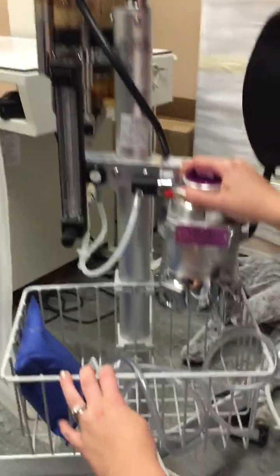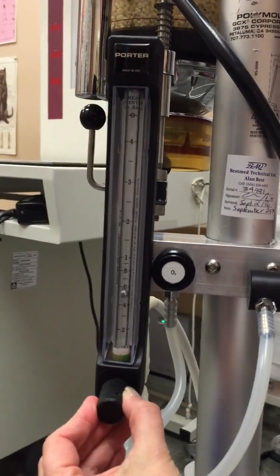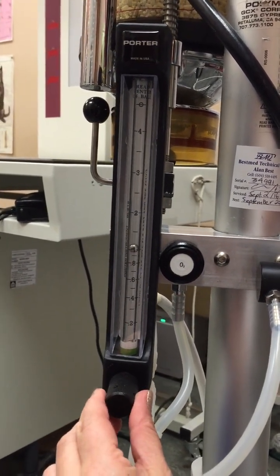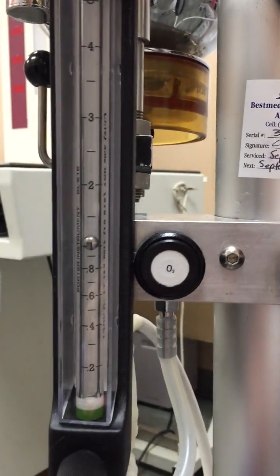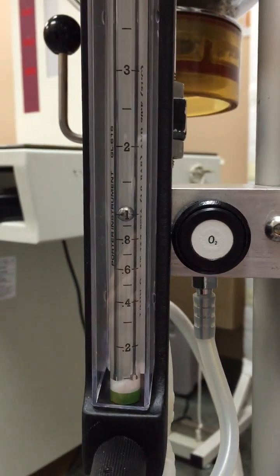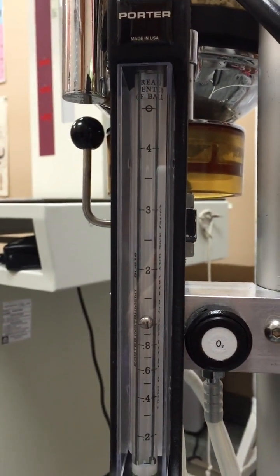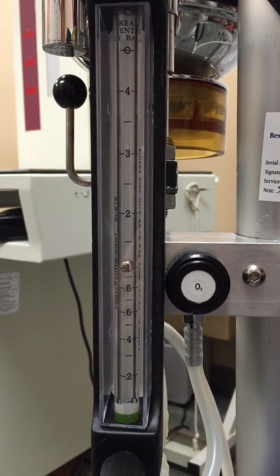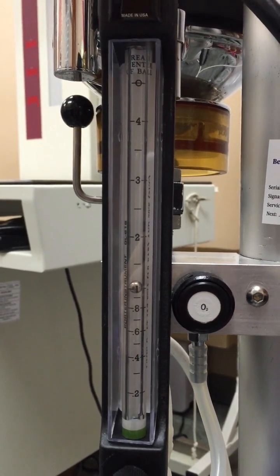All right, so if you're going to be using your flow meter, your oxygen is going to come in here. And to turn it on, you turn it counterclockwise, and you'll note that there's a little ball that will move and let you know where your oxygen settings are at. Right now, I have it at 1 liter per minute. Note the graduations on your flow meter because every flow meter will be a little bit different. Some will go up by mils, some will go up by liters, so you do need to be aware of the graduations and the scale on your flow meter.